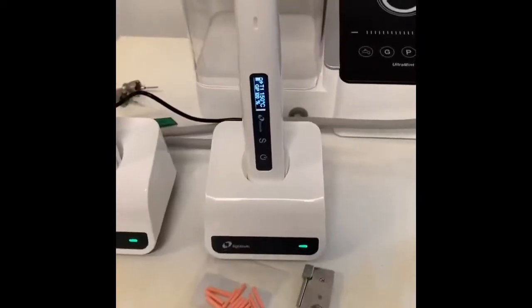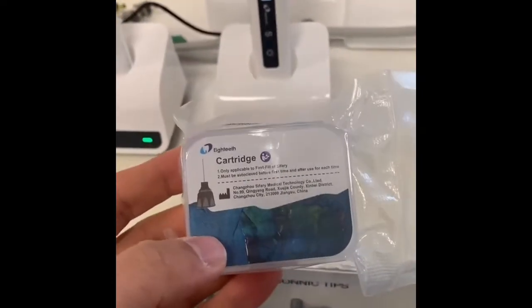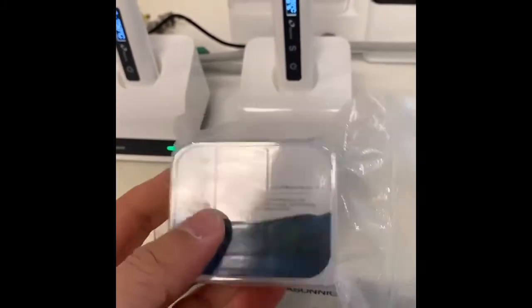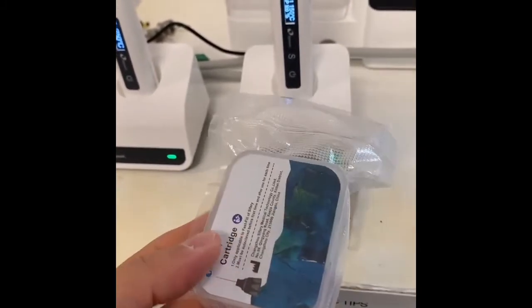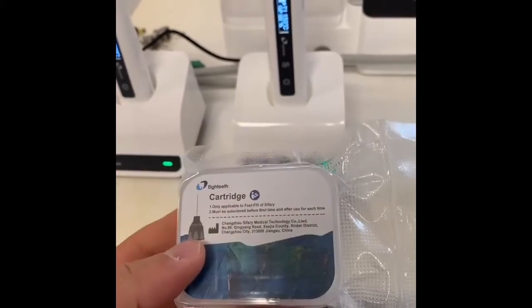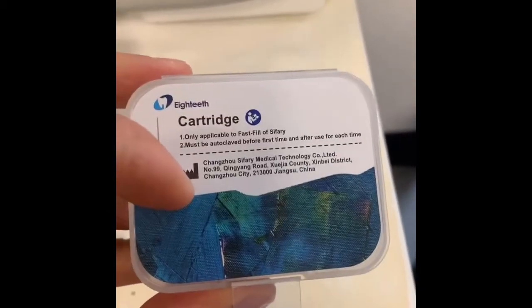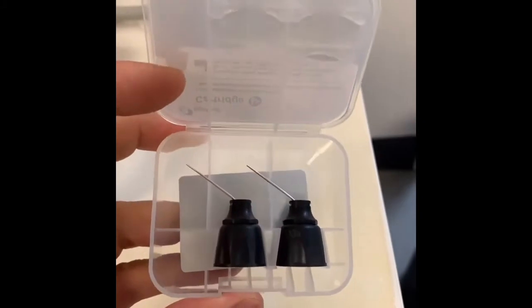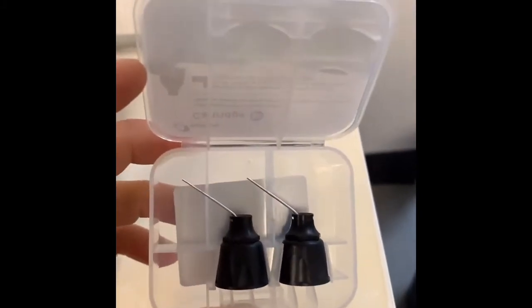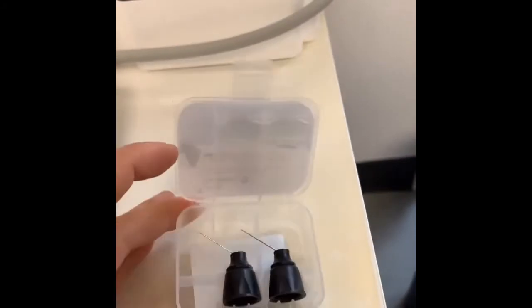Here it is and it's charging. When I talk about packaging — look at this, it's hermetically sealed. I have to break the seal now. Just beautifully packaged. Here's the other part — they call it a cartridge — and these are autoclavable. You can use them on multiple patients; you just need to autoclave them after each patient.